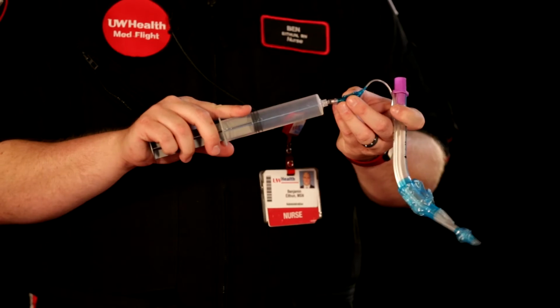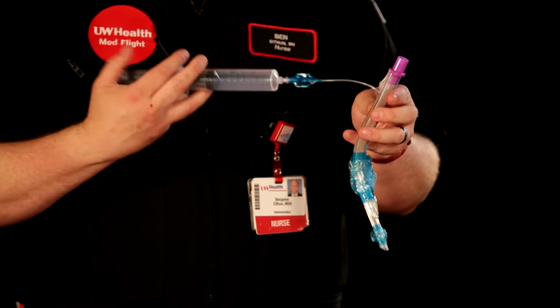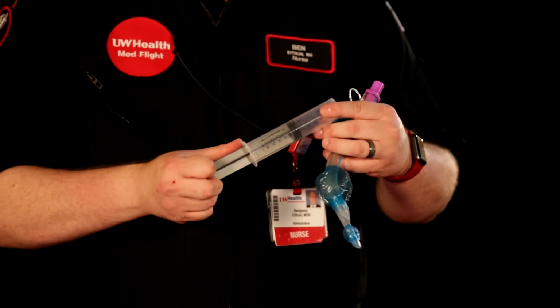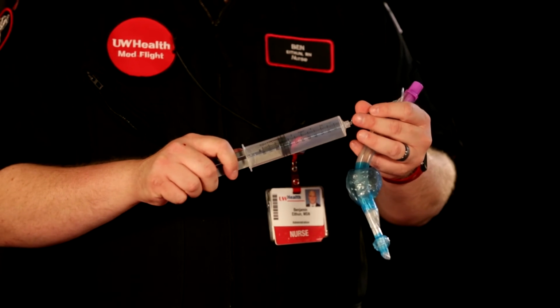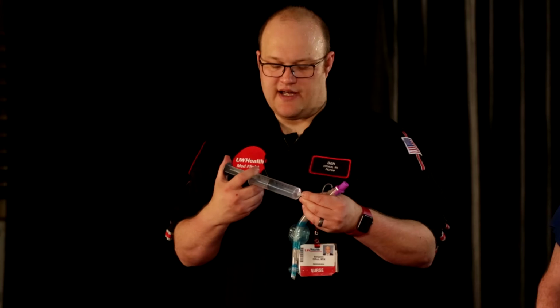So just to give you an idea what they look like when they're seated, after you place this, you're going to use the syringe that comes with it. There's also some lubrication to help make you successful in placing it. And you're going to want to instill air. The recommendation is going to be on the tube for how much air you want to instill. As you do that, you'll see that sometimes it's a lot more air than people think, especially if you've ever done an endotracheal tube. You're never going to put this much air in an endotracheal tube balloon, but in these tubes, it's a lot different.